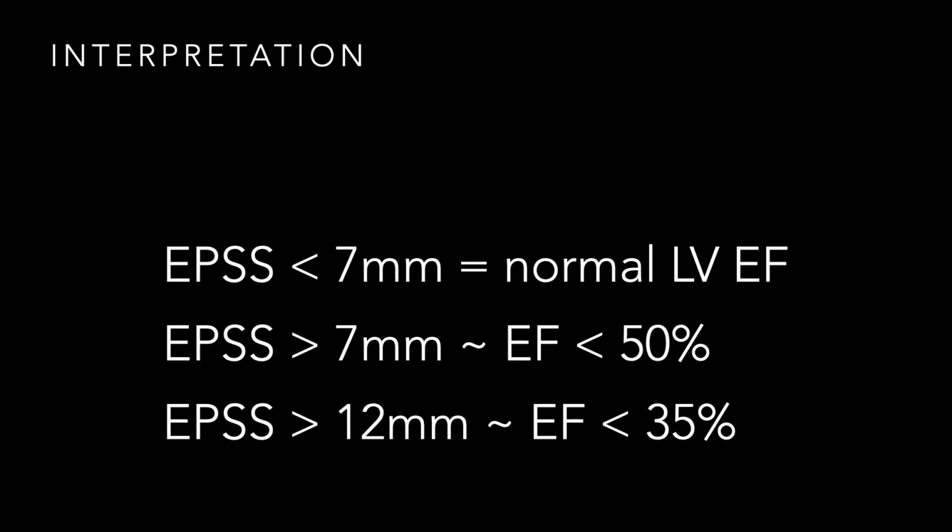And we talked a little bit about how there are some pitfalls, right? And one of the potential pitfalls that we ran into is mitral stenosis. So for the sake of today's conversation, let's assume that this patient that we have today has one of those pitfalls, namely mitral stenosis or some other thing, and really makes EPSS not a valid technique to be able to utilize as we're scanning these patients.